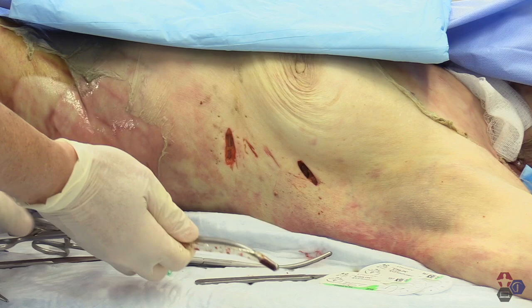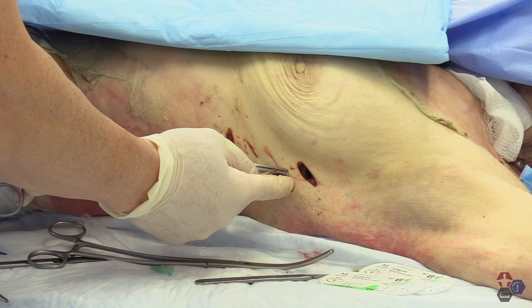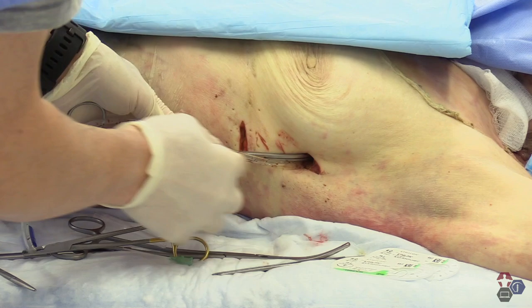This is where having your full PPE including shoe covers would be optimal. From this point on, first insert your finger and do a finger sweep in between both ribs, making sure that you can either feel the lung tissue, break up any adhesions, and most importantly, not hit any solid organs — which would indicate you're in the abdominal cavity. I like to leave the finger in place so you know exactly where the hole is and don't lose it, especially in some of the larger-chested individuals.